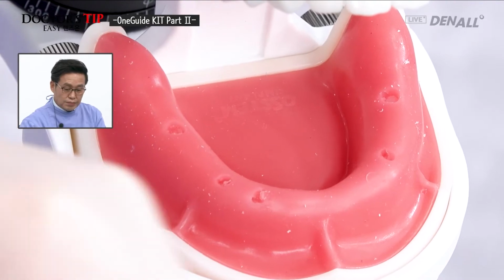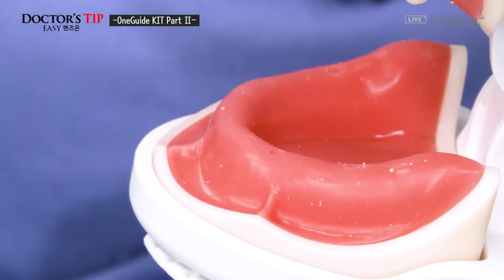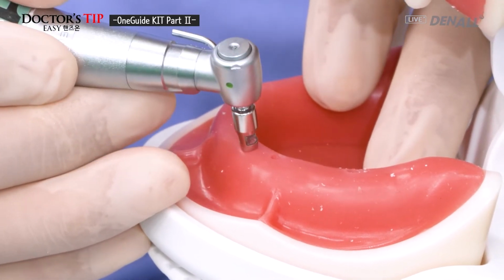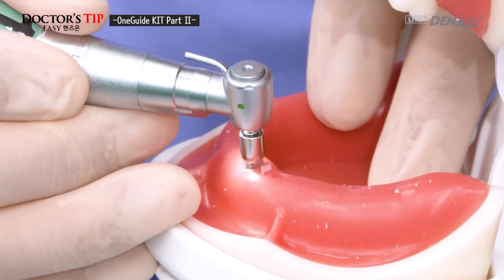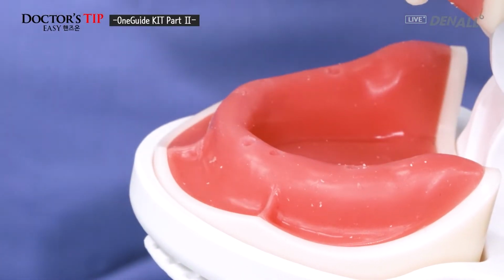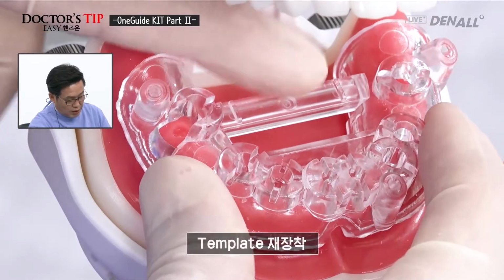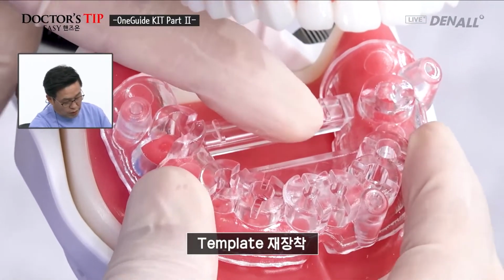Canine, it's not thoroughly done. Tissue punch is not thoroughly done, as shown. Tissue is removed. Tissue punch is complete. At this stage, check the position of the template.